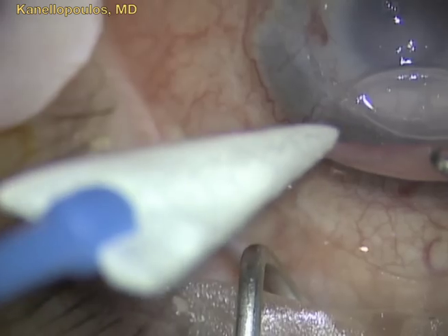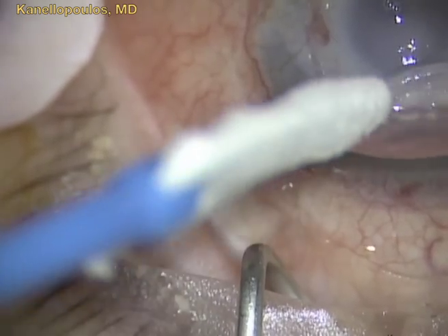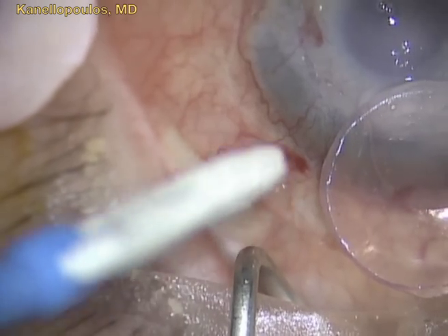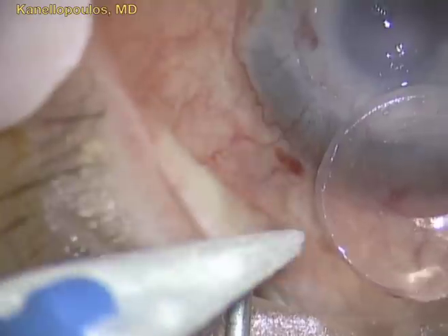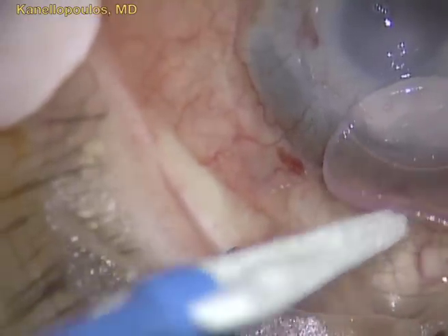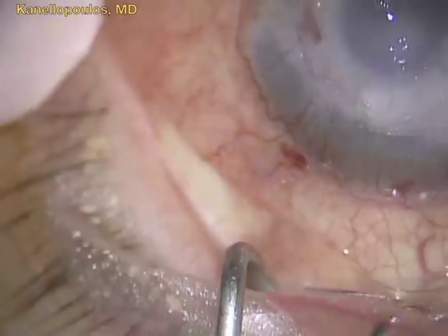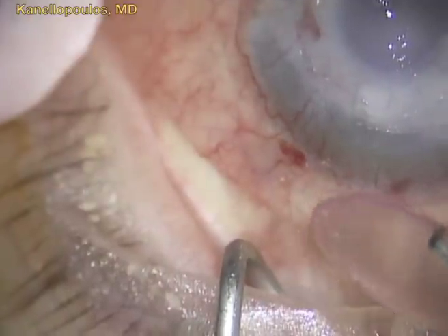As you can see here, we will create a step within the graft-host interface and increase stability of the graft. This is a unique advantage that femtosecond lasers are able to give in trefination of tissue and host in penetrating keratoplasty.